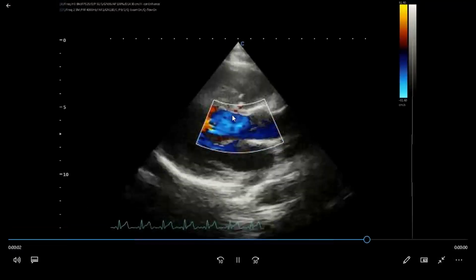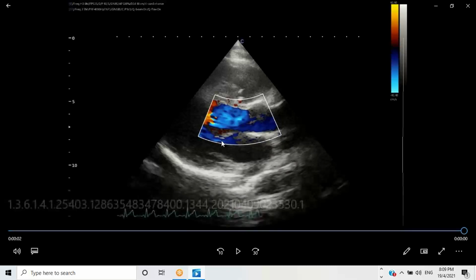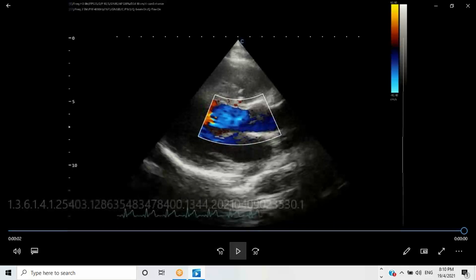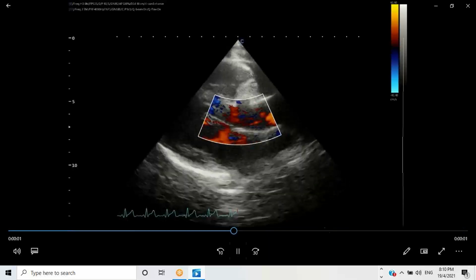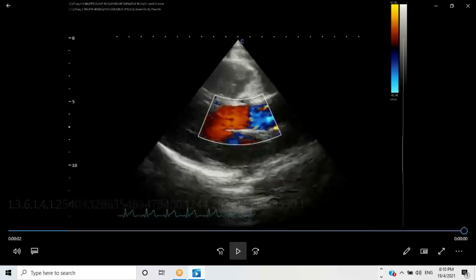So this is the color flow. You've got to put color flow across the valves because you want to see if there's any regurgitation, any leaks. So it's across the aortic valve, then you're going to put it across the mitral valve, and then, when you have appropriate views, you put it across the tricuspid valve and the pulmonic valve. So you have to do that. So we do color flow. Color flow is going to give you a quick qualitative assessment if there's any regurgitation or any abnormal flow. Then once you locate that, then you can do quantitative assessment.